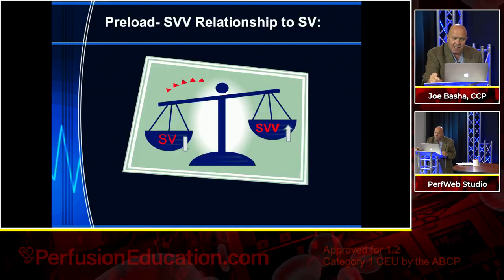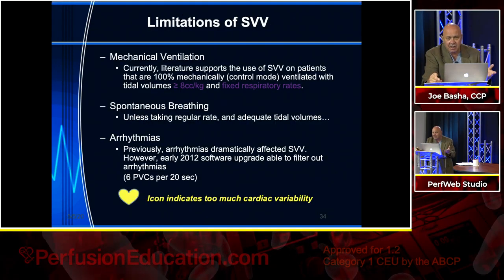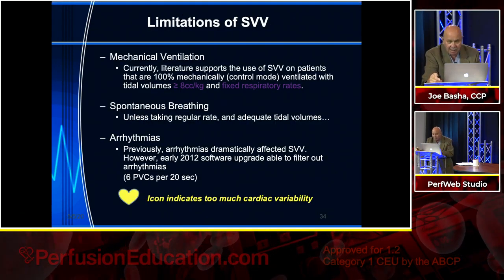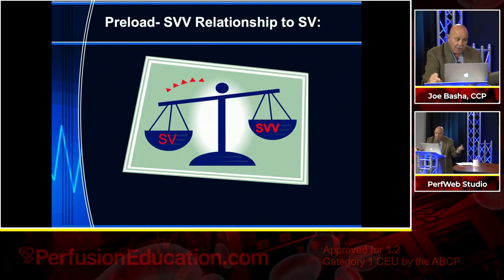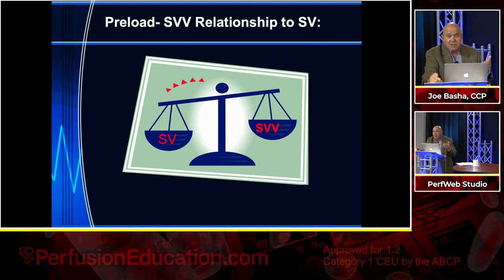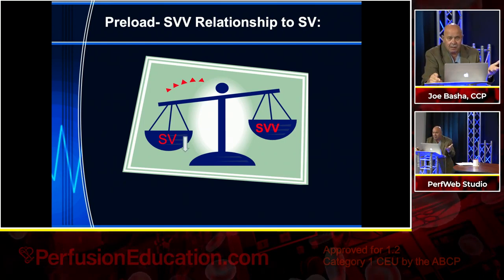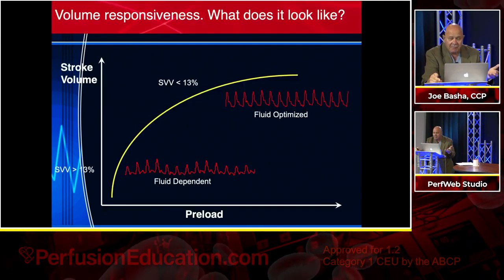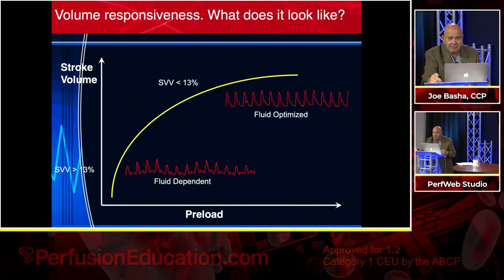Oh, did I do this slide? Oh, I'm sorry. Well, okay, I went ahead of myself. So there's the stroke volume variation. As stroke volume goes down, stroke volume variation increases. I talked about that. There you go, some fancy graphics. And this was the slide. I was on it on my computer because I have to look at it to see.